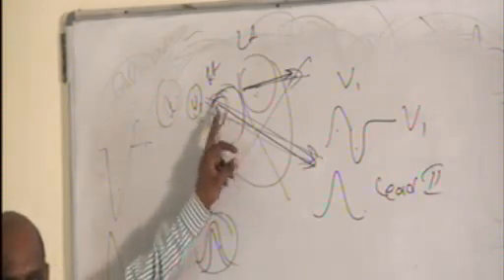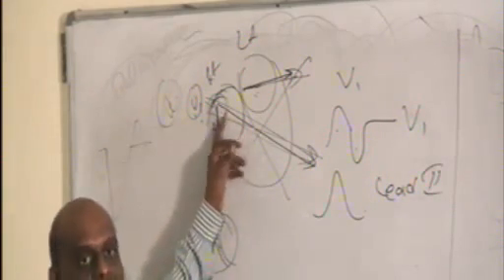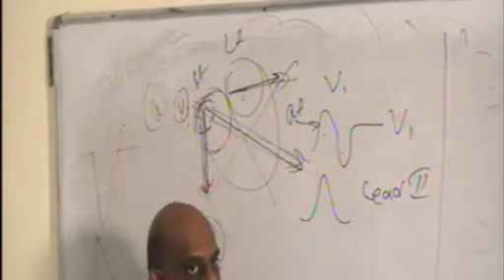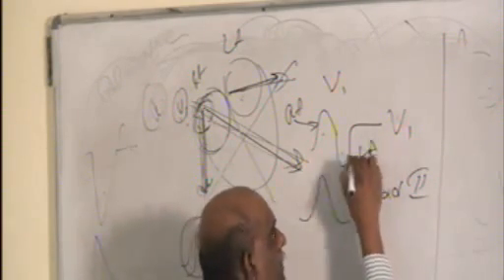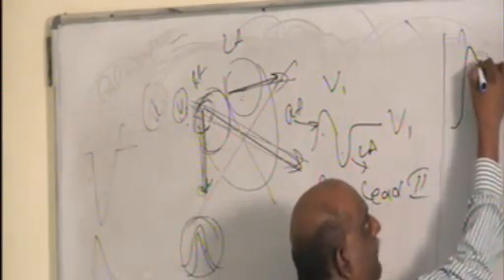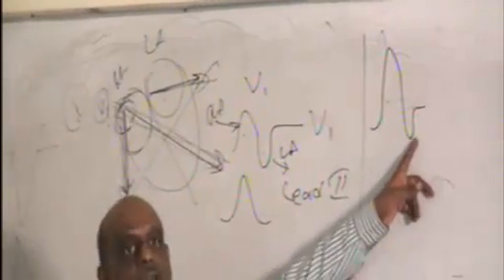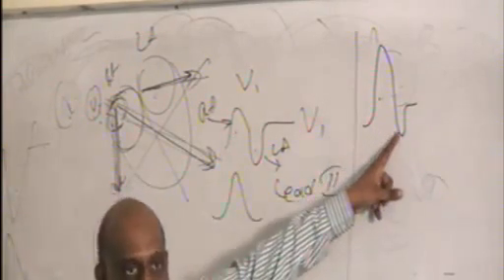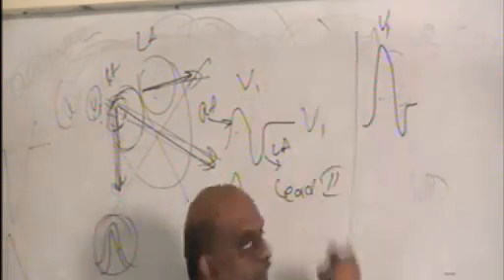Now, if right atrial enlargement is there first, what is the effect of right atrial enlargement on lead V1? The initial positive part is because of the right atrium. The negative part of this biphasic wave is due to the left atrium. That's the reason, if right atrial enlargement is there, you get a significant positive initial upstroke with a normal negative downstroke, and this will be the change in the morphology of the biphasic P wave in lead V1.